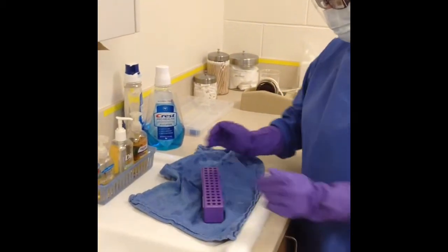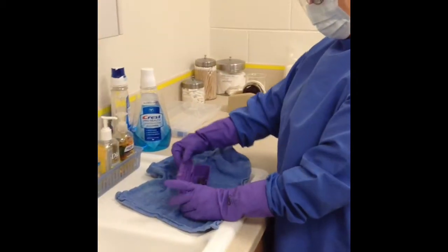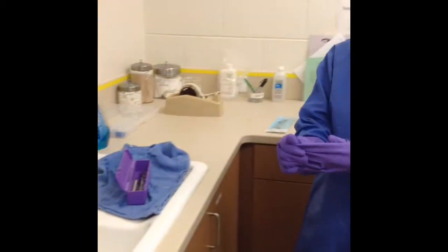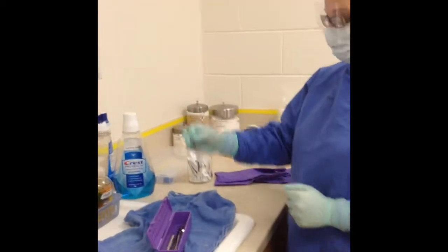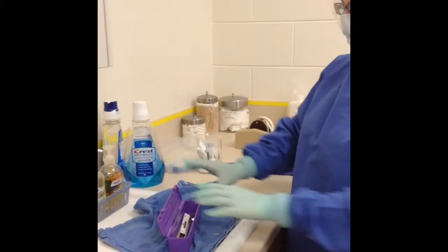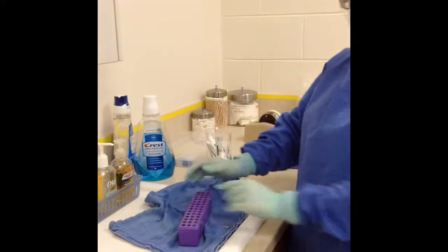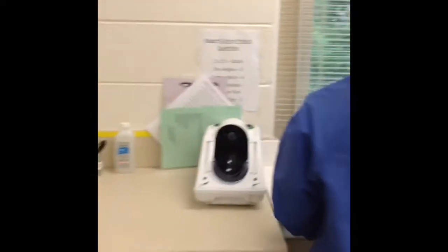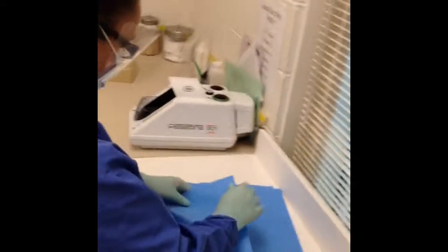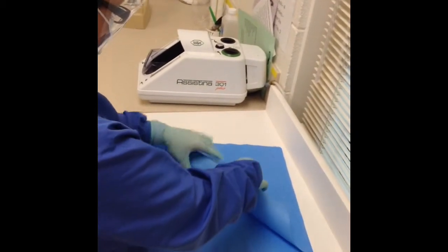We are also going to reduce the potential of accidentally tearing the paper due to the instruments still being wet. Now that her instruments are dried, Krista is ready to remove her purple utility gloves, perform hand hygiene, and put on her exam gloves. She is ready to take a sterilization strip and put it inside the cassette. This ensures that the inside of the cassette reaches the desired temperature as well as the outside. We are now going to move the cassette over to the blue wrap and start wrapping the cassette just like you would a Christmas present, making sure all areas of the cassette are covered.